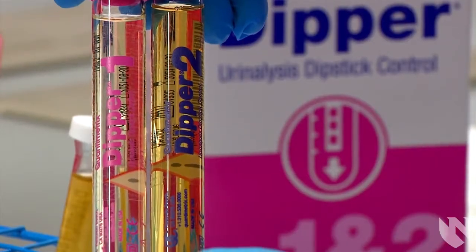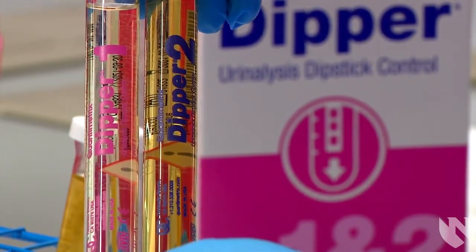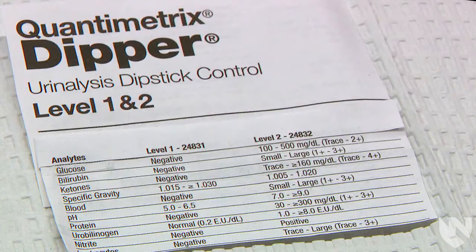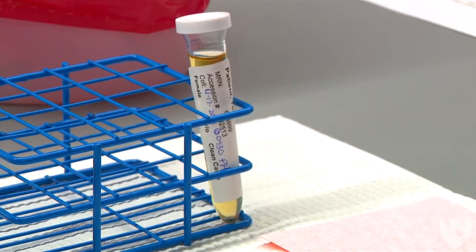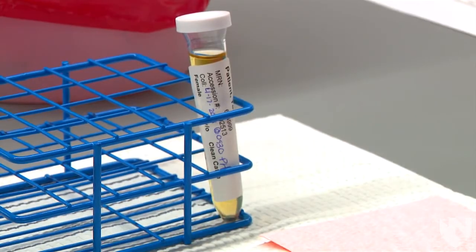Before any patient testing is performed, quality control needs to be completed on the reagent strips to ensure they are in proper working order. Once QC has been completed and all the reactions are within allowable limits, then patient testing can be performed. The specimen requirement for this test is an uncentrifuged room temperature urine in a conical tube containing anywhere from 10 to 15 mLs.